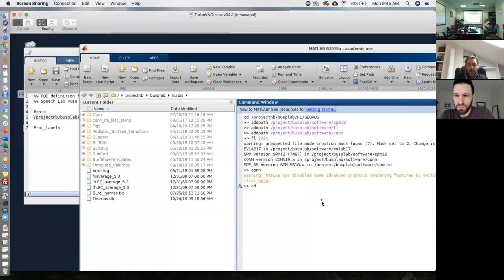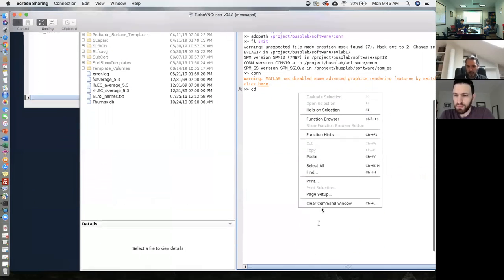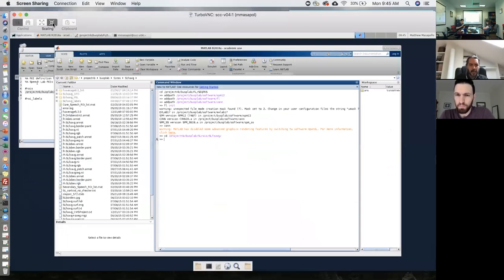What I want to check is that the annotation files are a little bit difficult to work with, because we don't have that many tools that work with annotation files. We can read them and create them, but it's not easy to change them. So I wanted to check whether we have something else in here that has already been converted to NIfTI files or something along those lines.